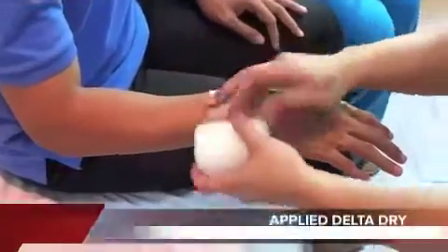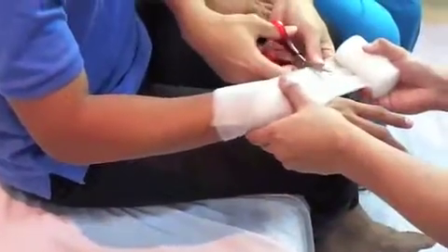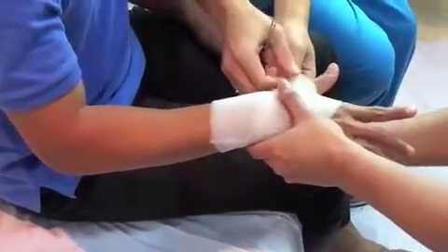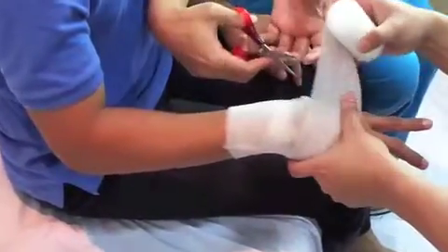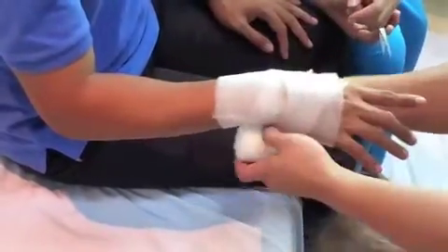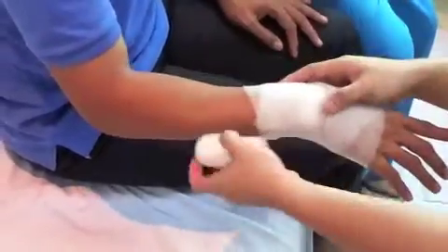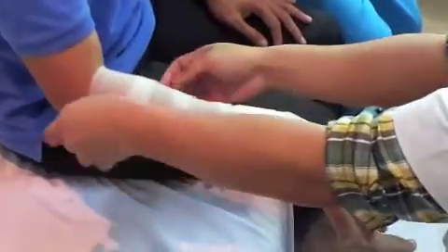Now, we will apply 2-3 layers of padding, going distally and trimming a little bit to anatomical position, tucking a little bit, then 2 or 3 layers at the distal and trimming with scissors. Then we go to the proximal, and from the proximal edge, we make it wider so it can be used as protection at the proximal side.